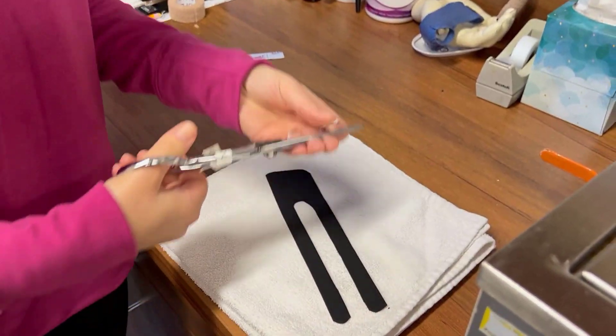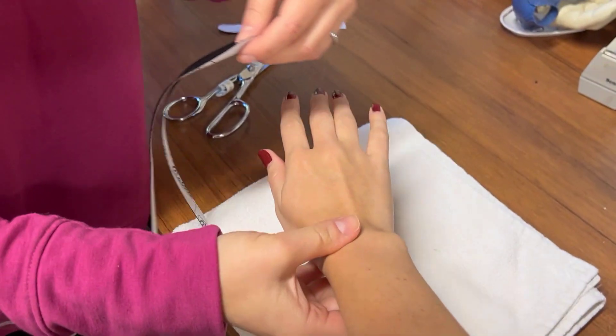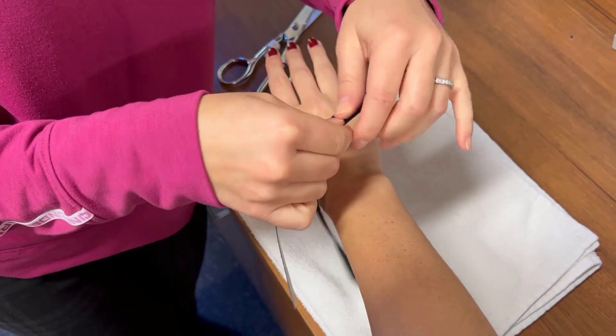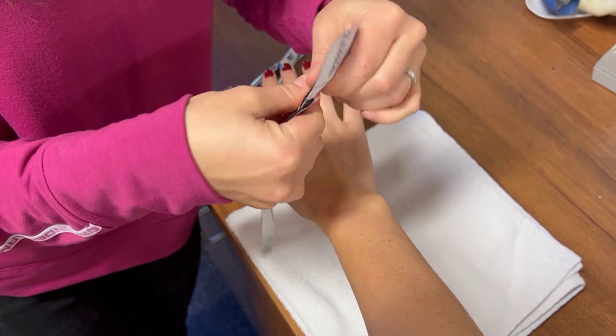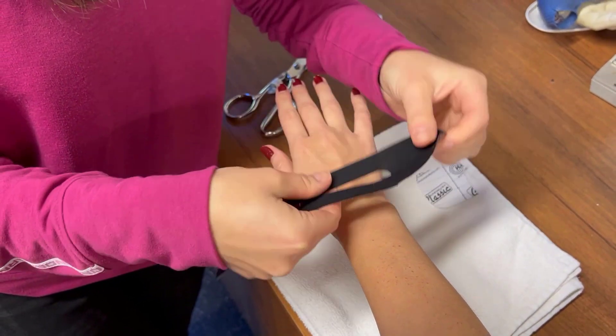The U-shaped opening in the tape will allow the ulnar styloid to come through. The tails will wrap around the wrist. Tear each tail and apply the anchor piece with no tension first.